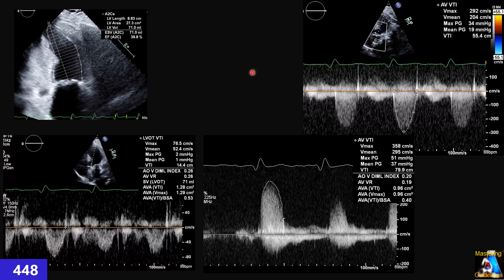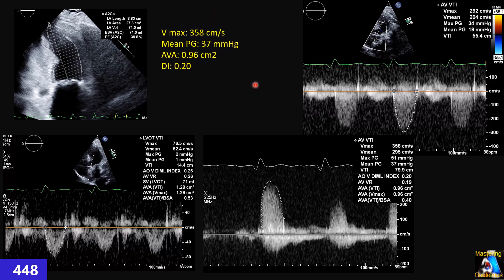After taking these measurements, we arrive at the following findings: Vmax below 4 m/s, mean pressure gradient below 40 mmHg, but aortic valve area below 1 cm² and dimensionless index below 0.25. So we have two criteria consistent with severe aortic stenosis and two criteria that do not match — there is a discrepancy. What do we do, what is the correct diagnosis, what do we need to calculate, and what is the next step?